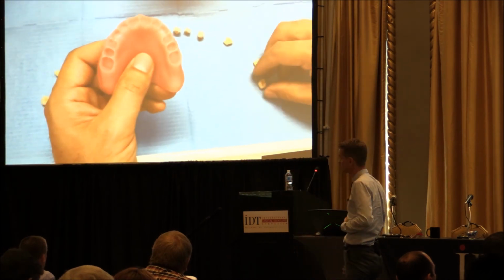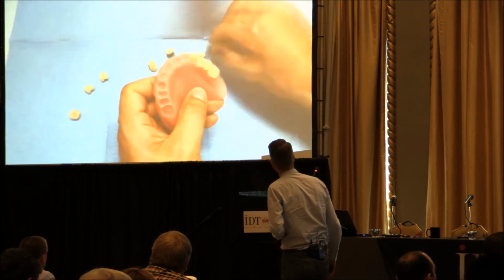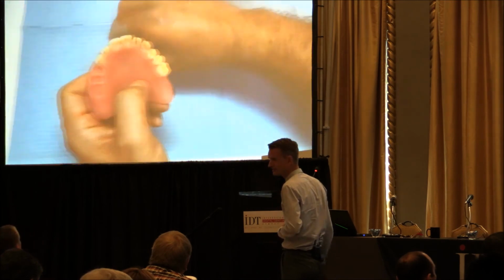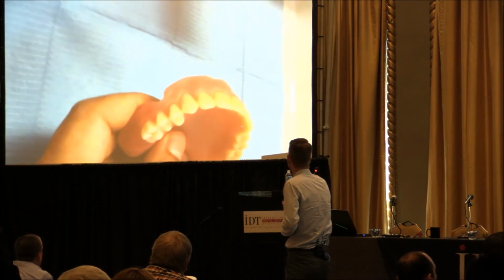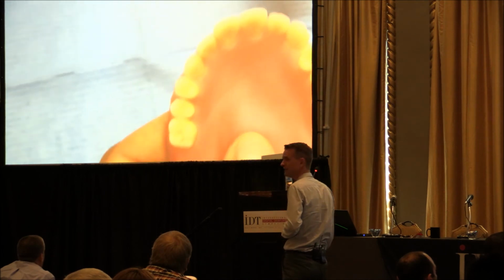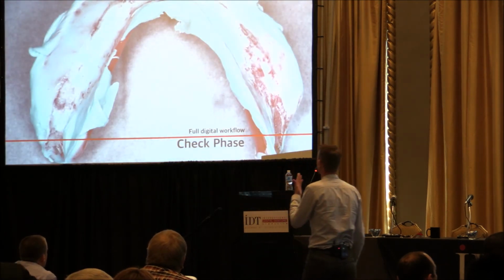He does base reduction. It's milled on the Roland here with Hyperdent. So assembly is a little bit easier. But if you look very carefully here, you see there are contact issues. I cannot see it here, but you have open contacts. Try to look there. Did you see the open contacts right there? So it's hard to maintain the contact on this, but it's working and it's cool.